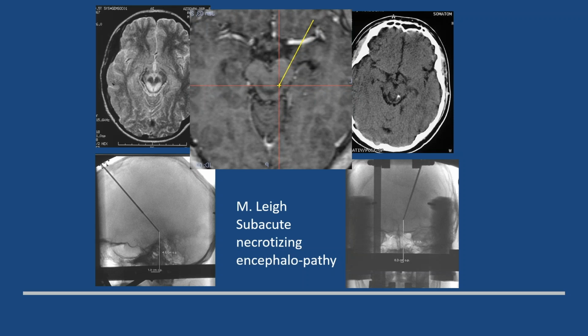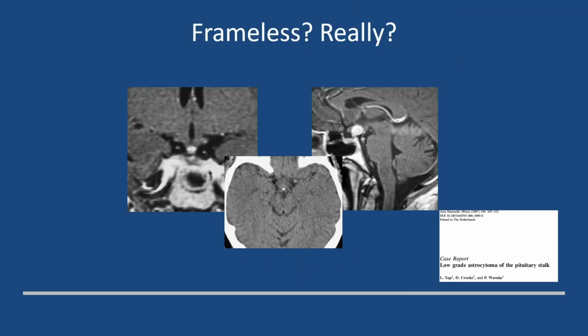And that actually leads to a significant increase in diagnostic yield, which in our series, which is more than 5,000 now, is about 97% from frame-based stereotactic biopsies. And it's particularly good if you have very delicate, very small lesions. This turned out to be a tumor of the infundibulum, which was a pilocytic astrocytoma. And again, on the CT scan, you see our marker is placed in the lesion.